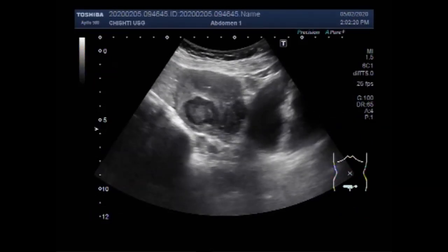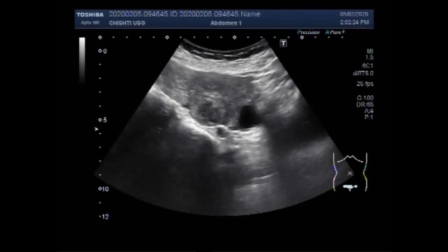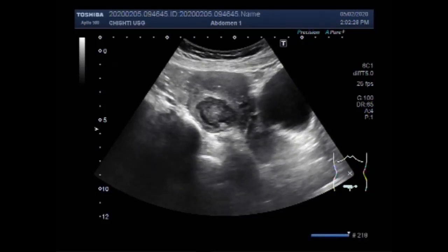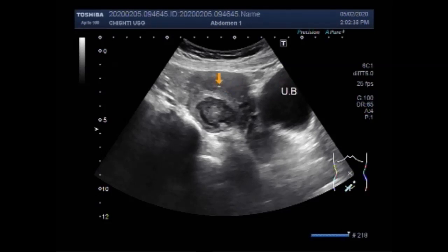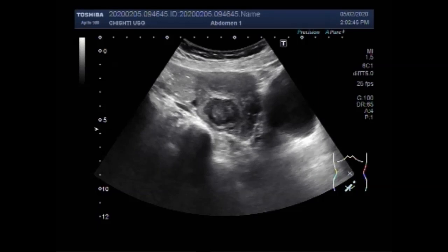You can see the uterus, urinary bladder, and this is the uterus. This is the urinary bladder, this one is the uterus, and this is the fibroid — the mass in the middle portion of the uterus near the posterior wall.